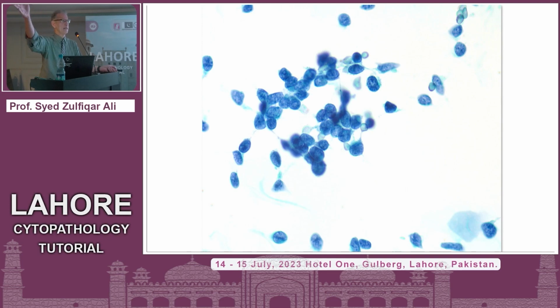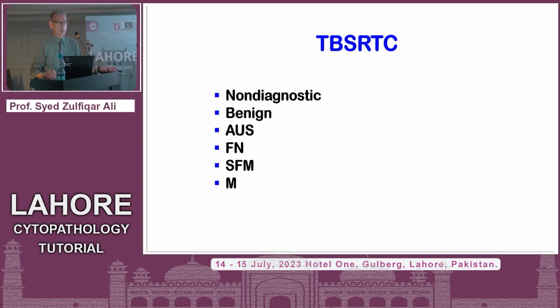Same nasty endocrinologist said, no way, the patient is a non-smoker. There's nothing in the lung. But we see small cell all the time where you don't see the lung lesion. It's an occult metastasis. It can happen. But he was not happy with that diagnosis. So let's apply the Bethesda system. Non-diagnostic, benign. This is the third time you could be wrong.